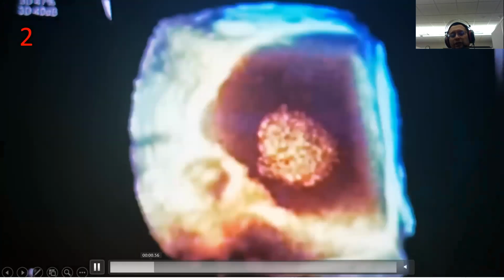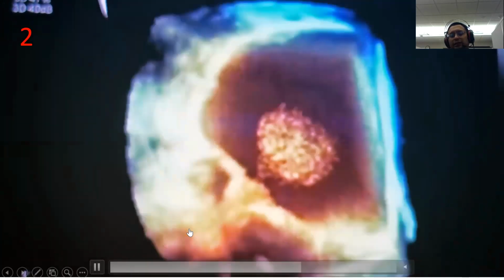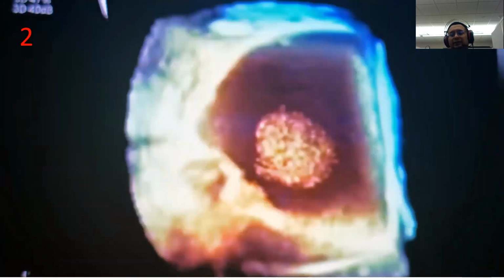That's the mass. Yes, correct. So this is a myxoma. Okay, so Ceiling is correct. Precious is correct. This is actually a myxoma. So I just wanted to show you that you can never be certain with echocardiogram. There's always a lot of different diagnoses going on. So this is actually a myxoma. It is actually a special type of myxoma called a cystic atrial myxoma.